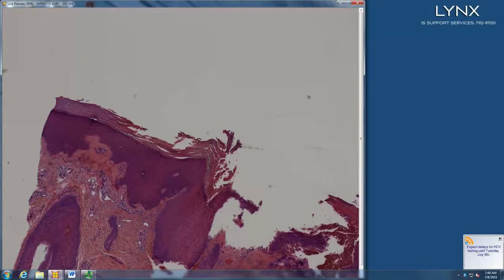So what would give you hyperkeratosis, acanthosis, and angiofibroplasia in the papillary dermis? Like stasis? Stasis would give you nodular, cannonball-like angioplasia. This is more like lichen simplex chronicus change. Sometimes you get vertical streaking of the collagen. Other times it's just angiofibroplasia of the papillary dermal collagen.